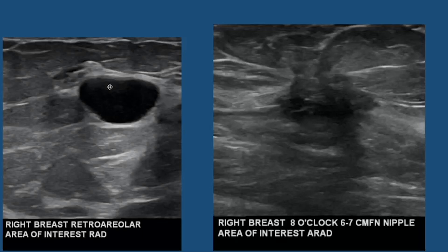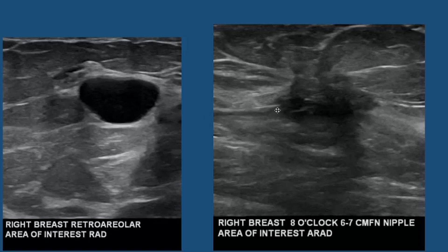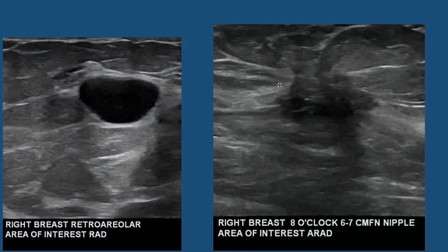A simple cyst is a fluid-filled area. It is benign — not a cancer. It is typically black in the center on ultrasound and has pencil-thin margins. Deeper in the breast, at approximately the 8 o'clock position in the area of the more deep mammogram finding, we see an irregular, hypoechoic mass. The margins are not as well-defined — I cannot trace a pencil and define the wall as I can with the simple cyst.